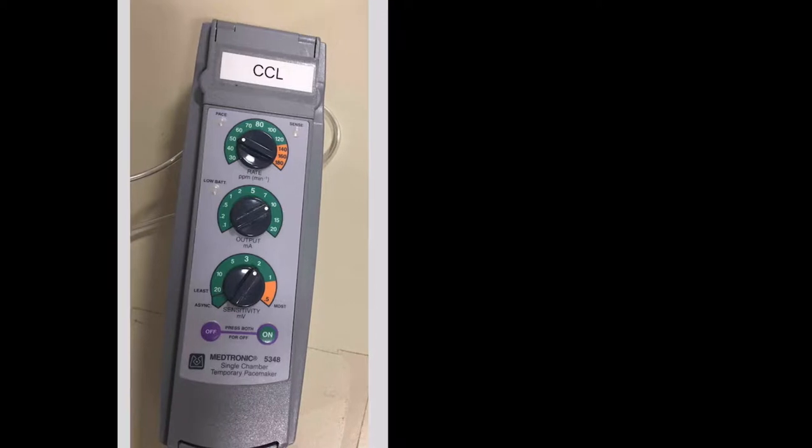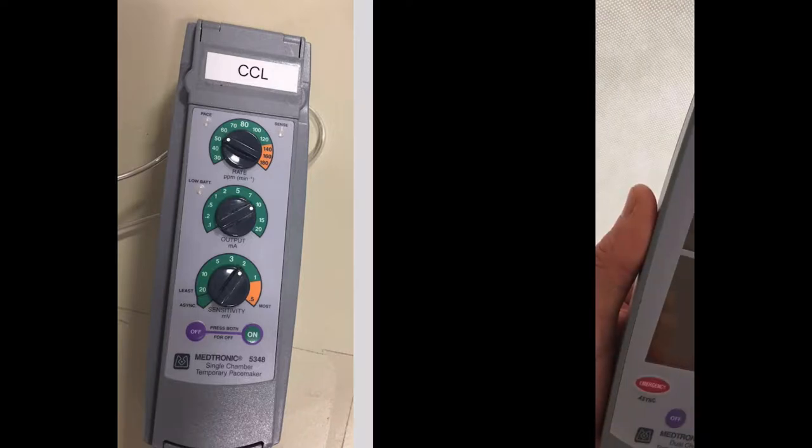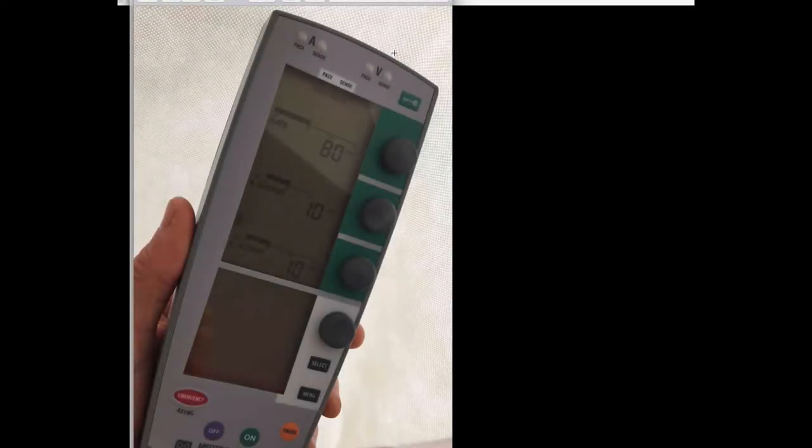The pacing units you'll actually be using are one of two types. The first is a single chamber unit, which you probably will not be using that much. More commonly you'll be using a dual chamber pacer, where you can plug in leads from the atrium, the ventricle, or both in the case of epicardial leads. For transvenous pacemakers, you just plug into the ventricle. These are nicer in that they have defaults: when you turn them on, the rate is already at 80 and atrial and ventricular output are set at 10 milliamps.